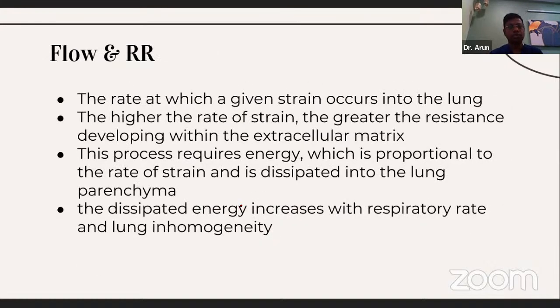So far we have discussed volume and pressure as causative agents of VILI, or ventilator-induced lung injury. At the same time, we shouldn't forget flow and respiratory rate. These are also components of VILI. And a big one is that the lung acts as a viscoelastic structure.